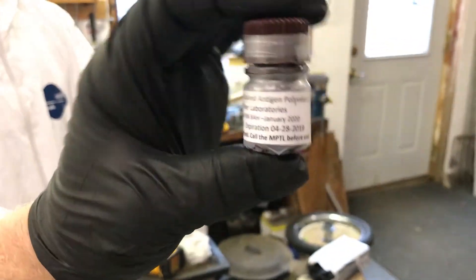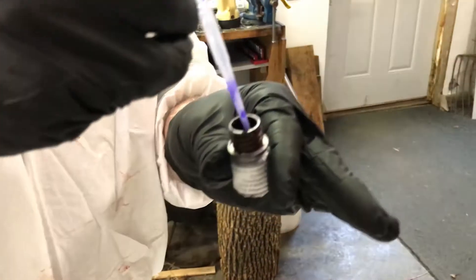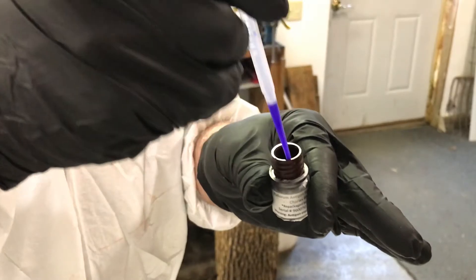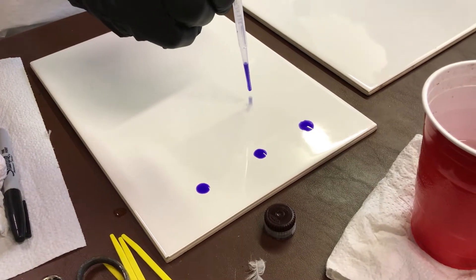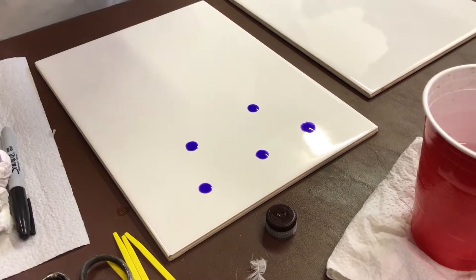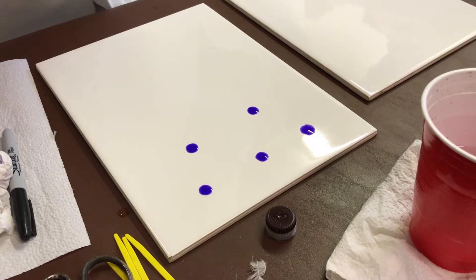Place one drop of antigen on the plate and look for evidence of autoagglutination or clumping. If there are questions about the quality of the antigen, such as autoagglutination, clumping, or expiration dates, call the Minnesota Board of Animal Health Poultry Testing Laboratory for guidance on how to proceed.